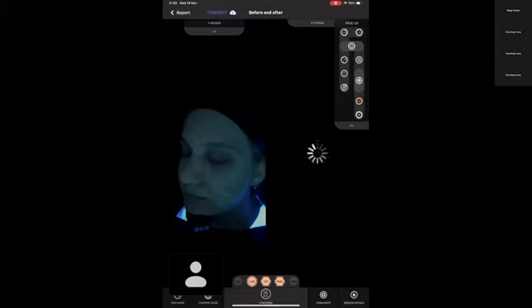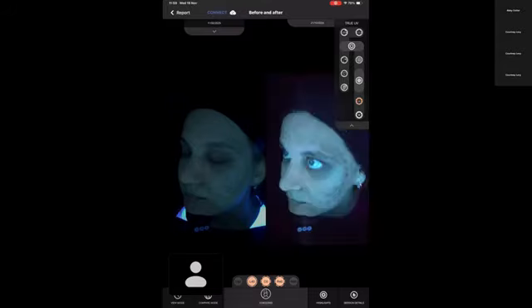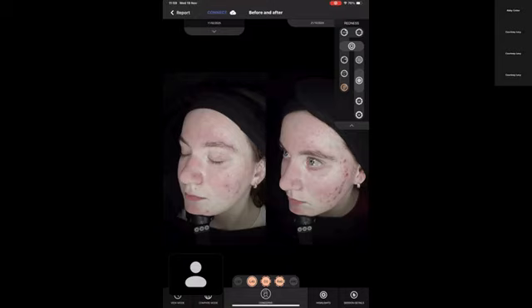Now I'm going to switch on to this, and here you can see how much the light has been absorbed by her white t-shirt and taken away from our image. So this is really too bad that we took these after photos. We want to show the patient, but we can't actually show her very nice quality images because we didn't standardize the image capture process. Here I want to show the redness.